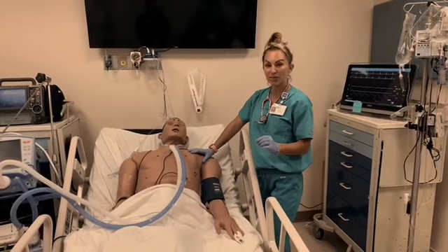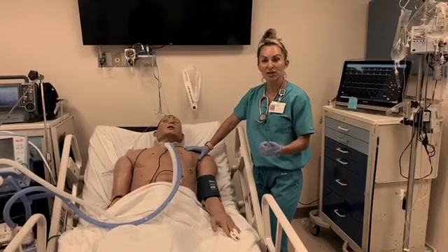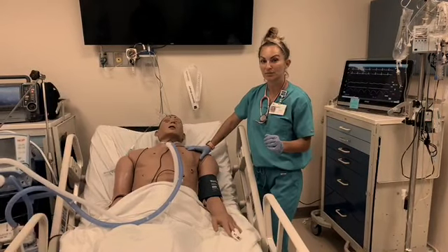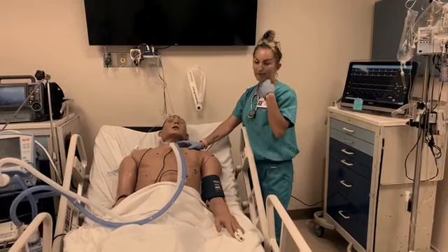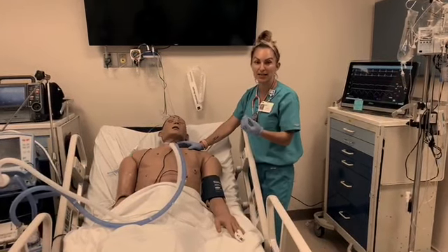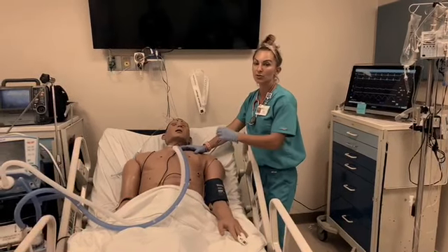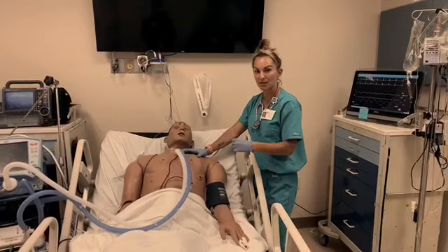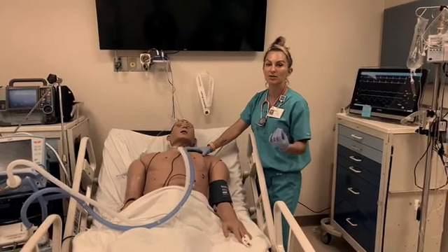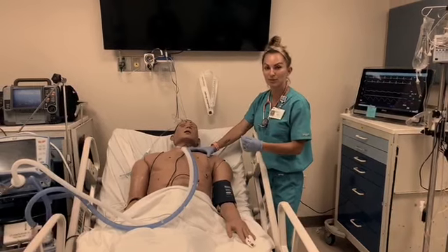Some late complications from tracheostomy placement include decannulation as well as risk for infection. Now, if say a patient coughs very heavily and they end up decannulating themselves, you need to contact the physician and anticipate that you're going to be replacing that inner cannula. You will not be putting it back in. You will be replacing it because our inner cannulas here are disposable. They will be thrown away and you'll replace it with a new one.